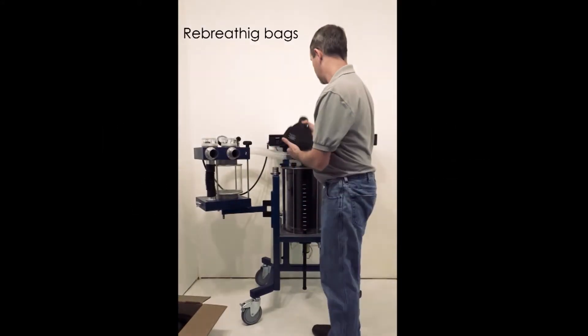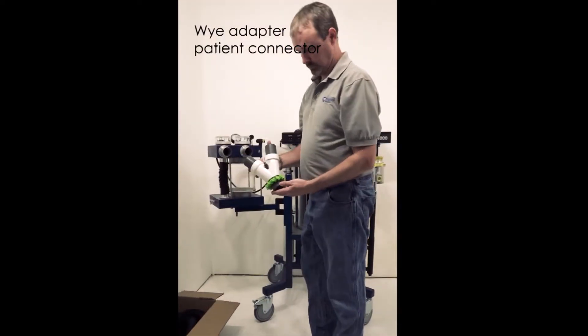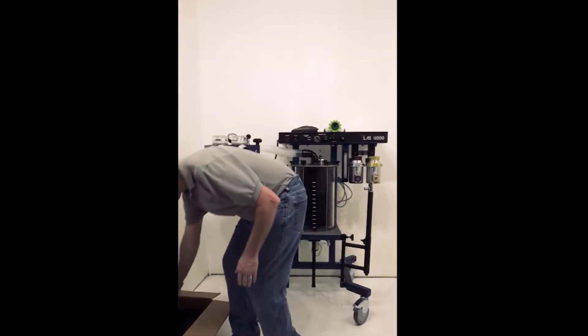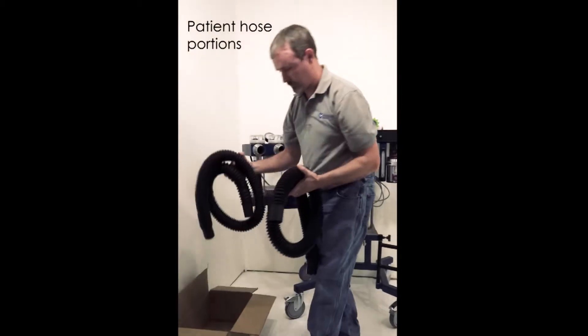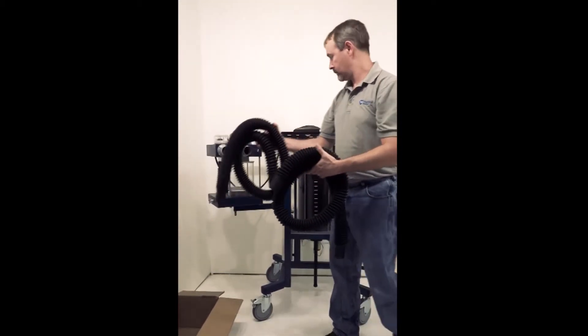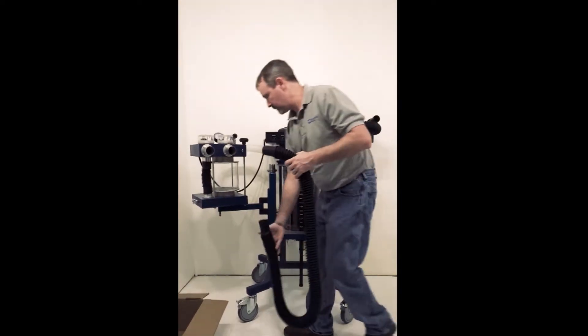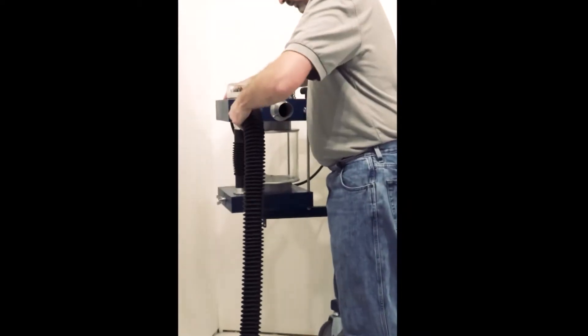Next, you'll find in the accessories kit rebreathing bags of several sizes, the Y adapter patient connector, and patient hose portions for the left and right limb of the breathing circuit. Firmly attach one hose to the inspiratory and expiratory ports attached to the CO2 housing.